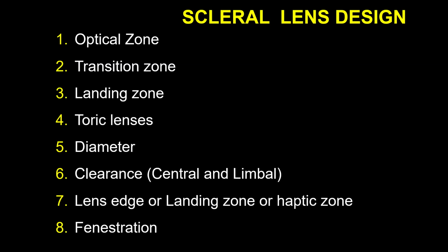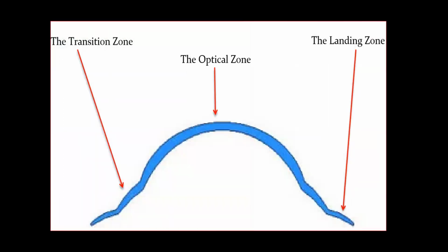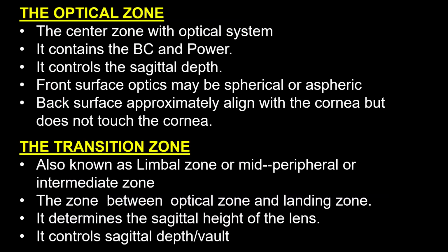Because of the challenge of corneal hypoxia in scleral contact lenses, some manufacturers include designs that have tiny holes in them to improve tear circulation and oxygen permeability to the cornea. So that's something you should be aware of in ordering any type of corneal scleral contact lens, depending on what you want and when you need it. That can also form a question for discussion.